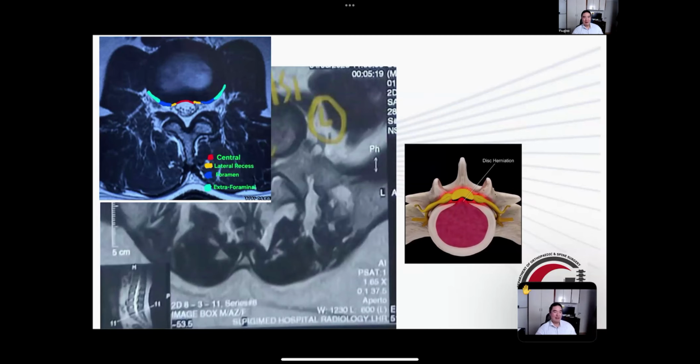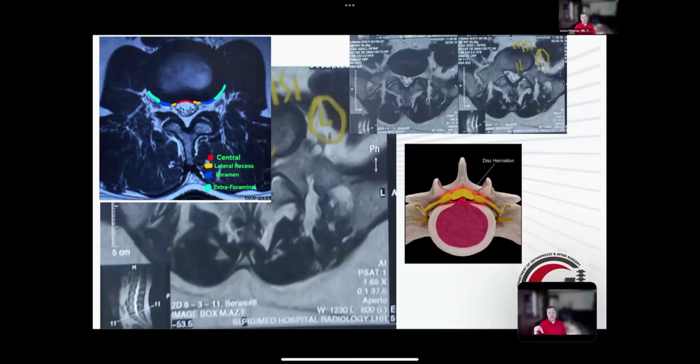For L5-S1, I wouldn't recommend the foraminal approach. Rafael is right. The other issue, other than the ilium, is how the nerve root drapes across the disc when it exits at L5-S1. The nerve root tends to sit lower in the foramen at L5-S1. Your traditional transforaminal approach is into Kambin's triangle, and Kambin's triangle at L5-S1 is much smaller than at the other levels. Everyone here will say one of the hardest parts of this surgery is simply finding where to put your portals.